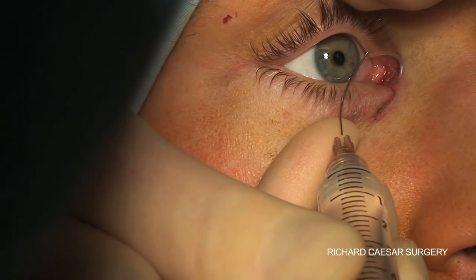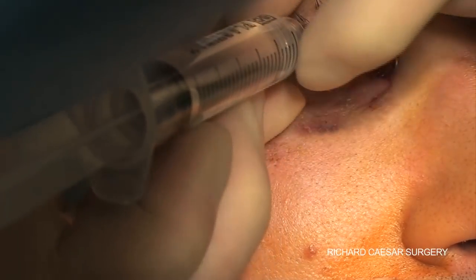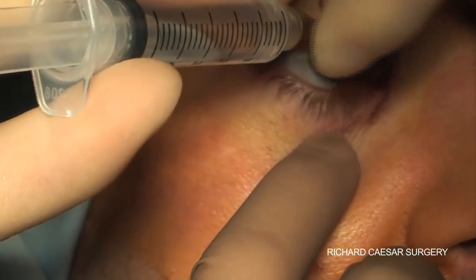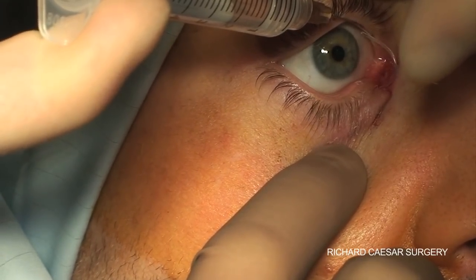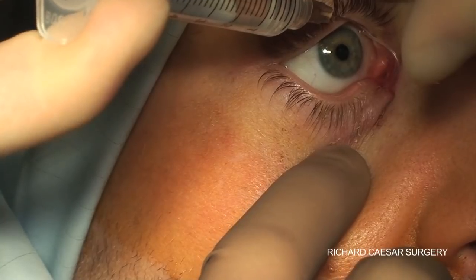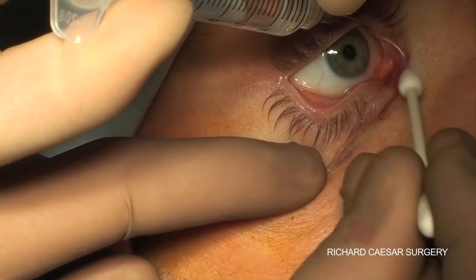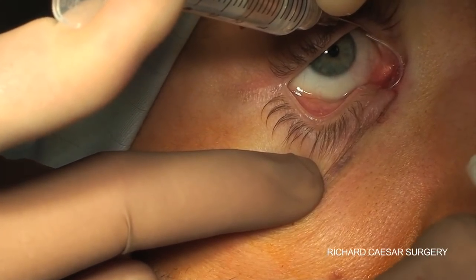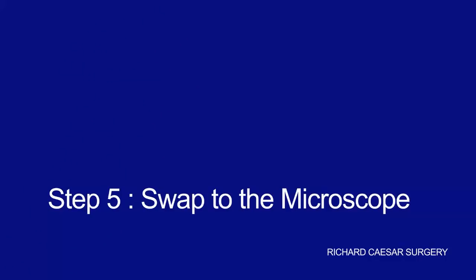Now initially here I'm finding it difficult to find it despite the phenylephrine, so I'm going for the next trick here, which is to inject either air or in this case saline into the sac through the upper intact canaliculus and see if you can see a jet of water coming out. Now it doesn't show up particularly well on this video, but I was able to see where the little jet was coming from. So the next step was to swap to the operating microscope.